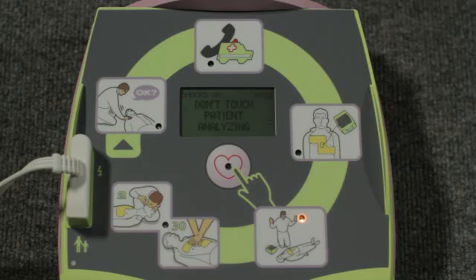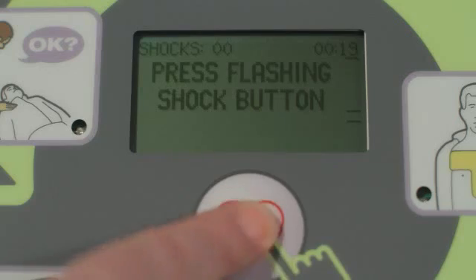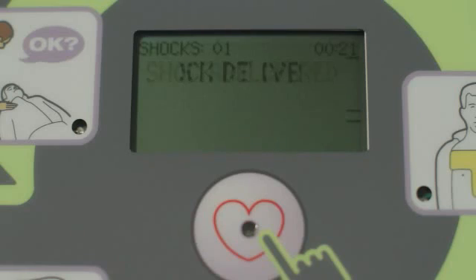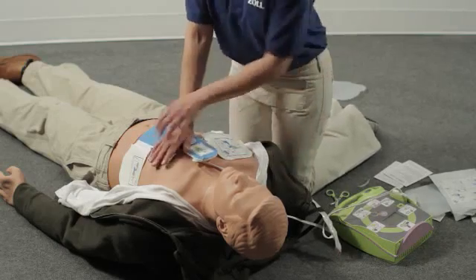Don't touch the person while the AED is analyzing the heart. If a shock is needed, be sure that no one is touching the person. Shock delivered. After the shock, immediately start CPR. Do your compressions by pushing down on the CPR landmark.